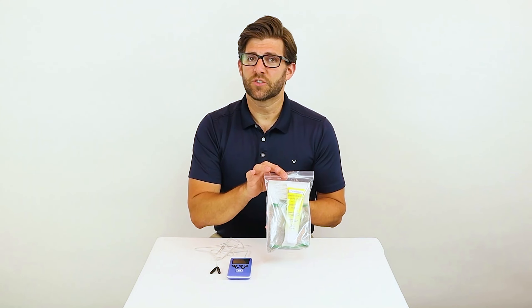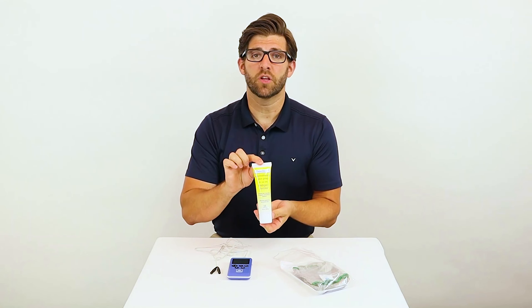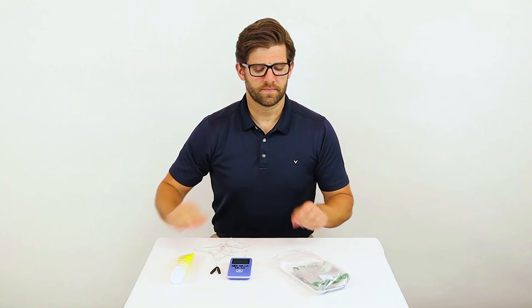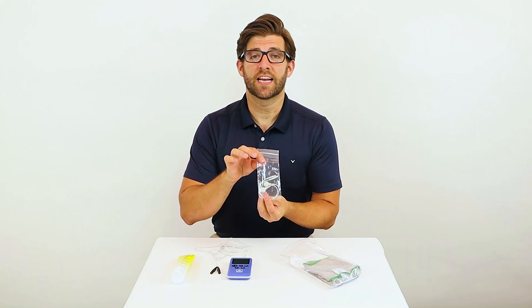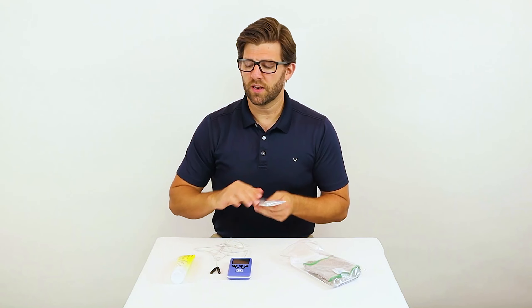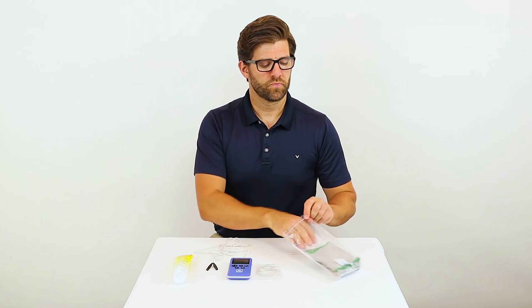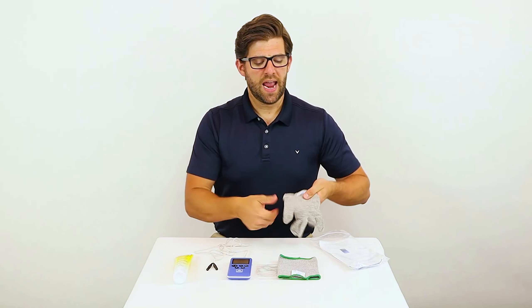When you receive your accessory kit, it will come with five items in it. The first item is Theracream, which is a conductive lotion that you put on before you don your garments. Next are the specific connectors for the garments. These plug into your lead wires that you already have.